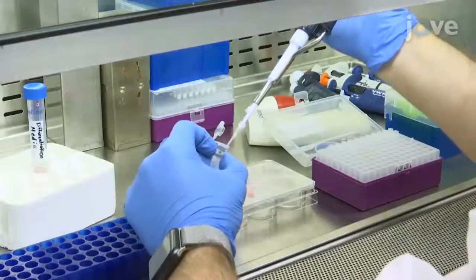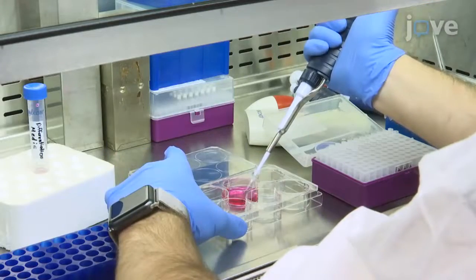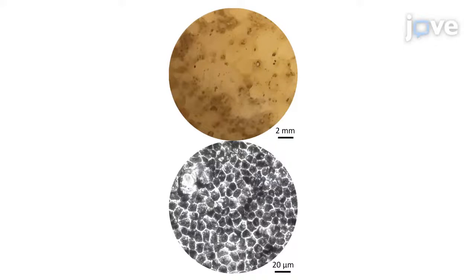After 2 weeks of culture, supplement the differentiation medium with 100 ng per mL of human activin A, changing the supplemented media 3 times a week for another 14 days. On day 29, switch to non-supplemented differentiation medium for another 8 to 10 weeks until pigmented RPE cell clusters appear.